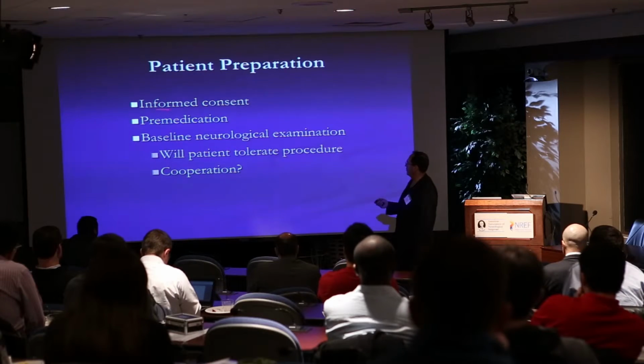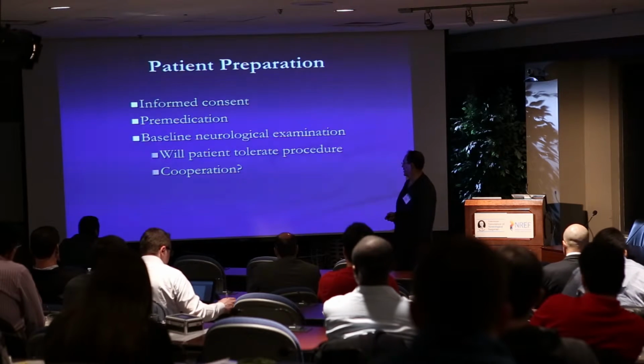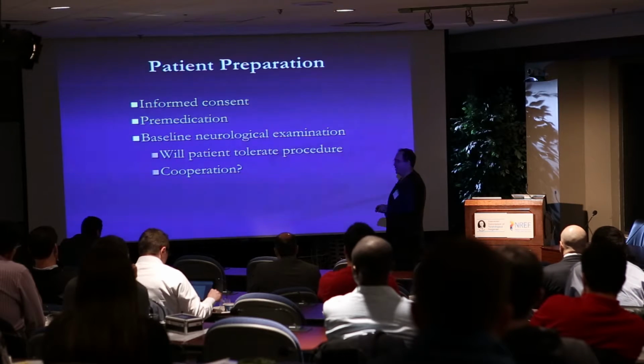We already talked about informed consent and in some cases pre-medication of people that have true documented contrast allergies. Whenever possible, obviously you want a baseline neurological examination. You want to know if the patient's going to tolerate the procedure. So if you're not doing it under general anesthesia and it's going to be a conscious sedation case, we've all been in a situation. I know that when I give conscious sedation, I leave my patients a little light. So I can talk to them, I can communicate with them, they can hold still when I ask them to hold still.